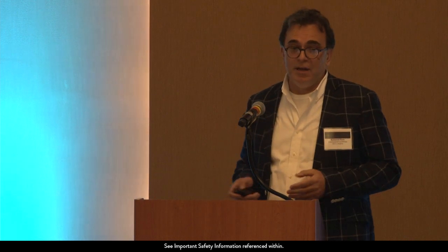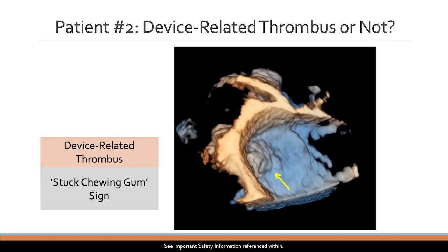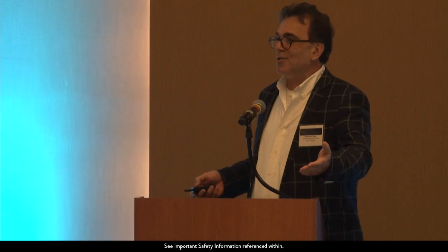But then you turn on, and then what I called, I have to come up with words. So this, I call it the stuck chewing gum sign, okay? It's like somebody takes chewing gum and sticks it on a desk or table, and that's how it has to look. So chewing style, not bad. English is my second language.